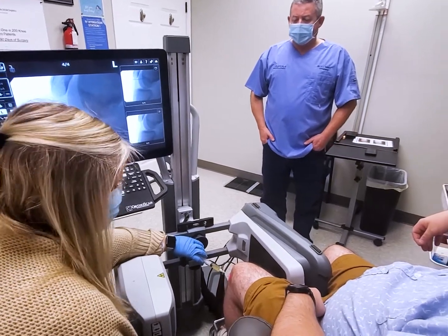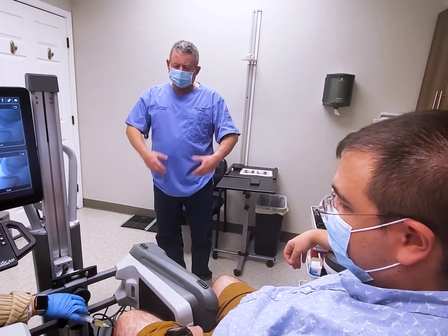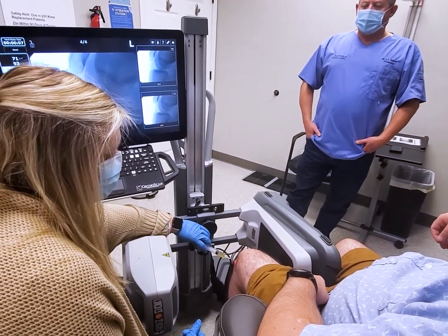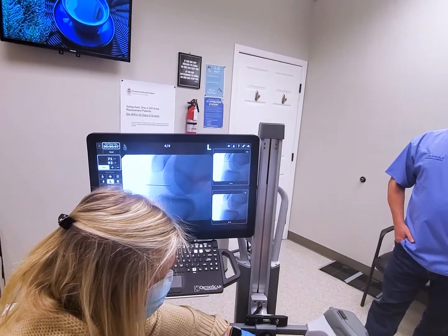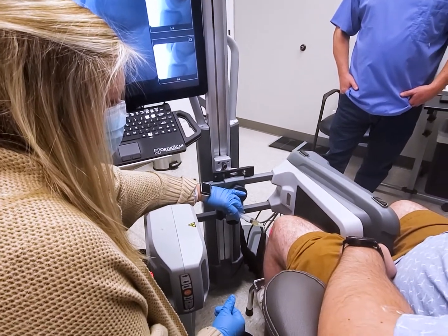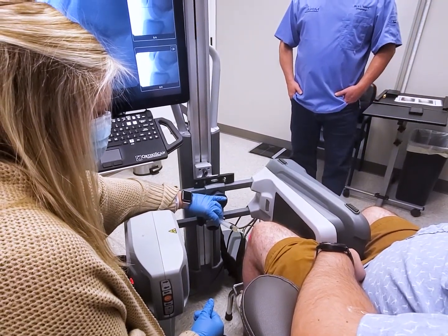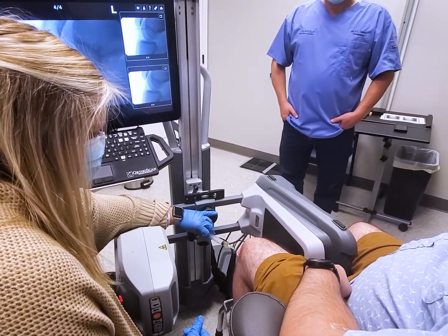Still feeling okay? Mm-hmm. So Kelly, are you changing the angle to make sure that you get distribution across all the surfaces? Yeah. So that's the other thing. I like to, the term that they use is pepper. So I inject a little bit of platelet rich plasma in kind of multiple angles just to make sure that I'm coating the entire area with those platelets. Platelets are attracted to inflammation, and obviously the inflammation is typically not in just one area. Still feeling okay? Yep. Good. Just pressure? Just a lot of pressure.